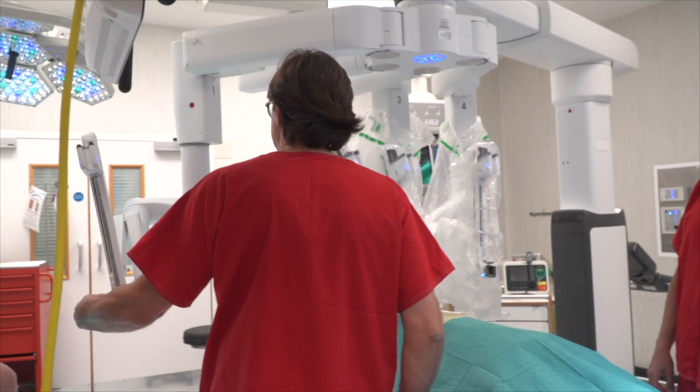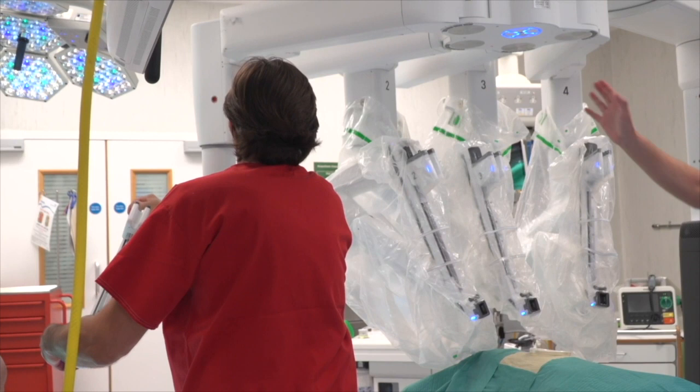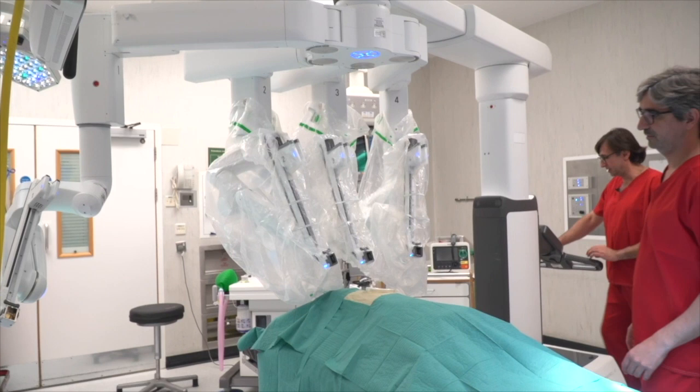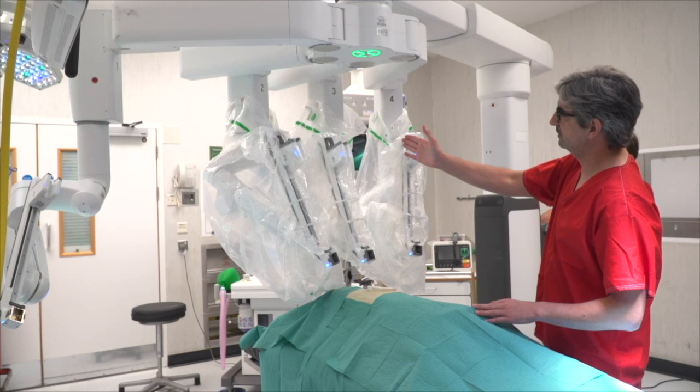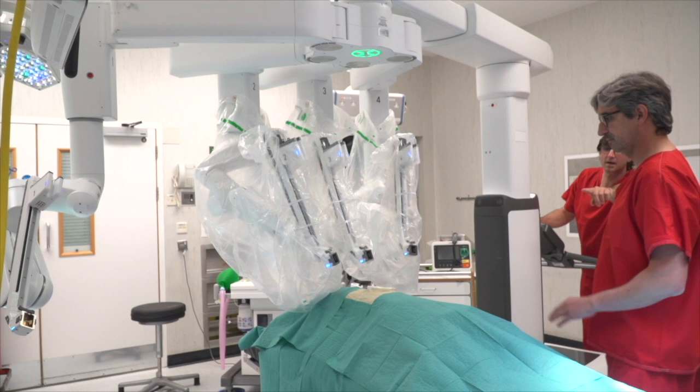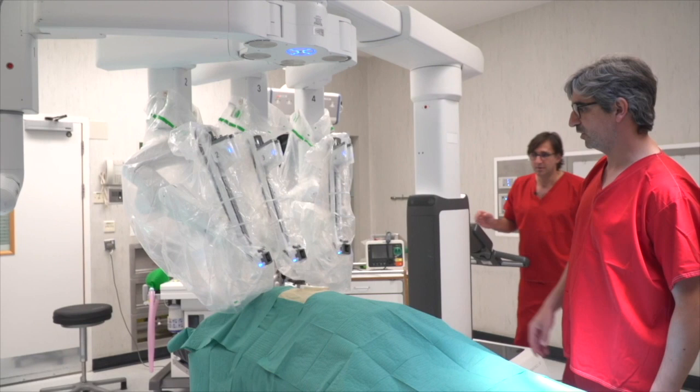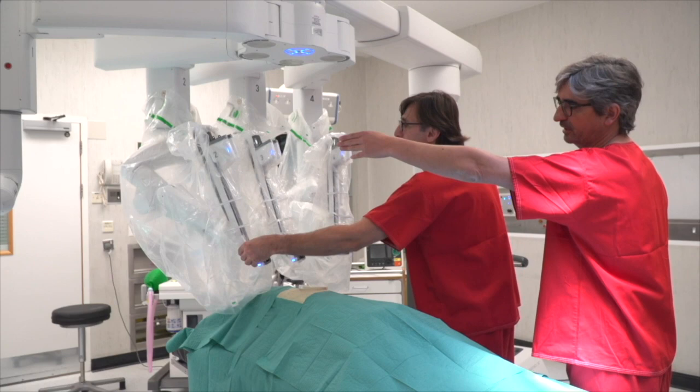And Mugu, you can explain. We always have it vertical, but we can rotate a little bit more. We can rotate the boom a little bit more, because the line must be parallel with the patient. A little bit more rotation here. Okay, you see the line, the long line must be parallel with the table. Yes, the cross at the upper part of the incision and the line parallel with the patient. More or less parallel, this line. Yes. Okay. And now we use arm two for the camera. For the camera, have the trocars.